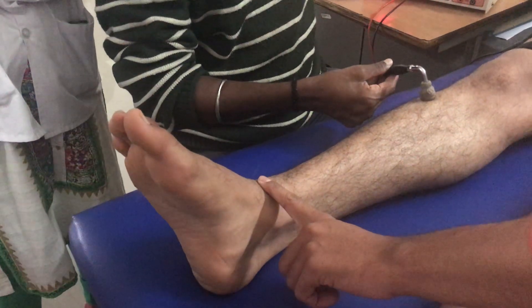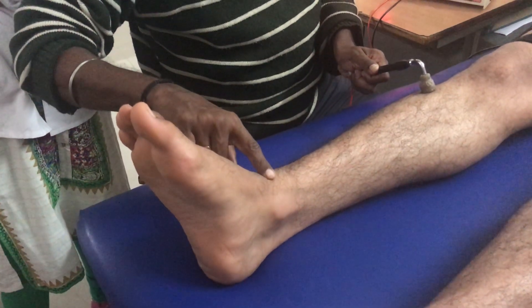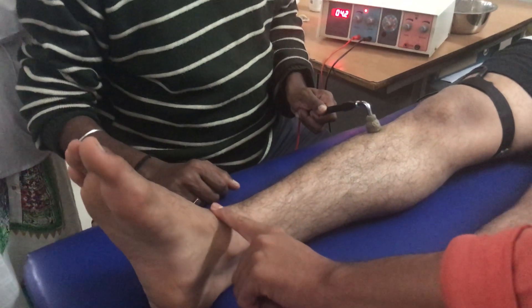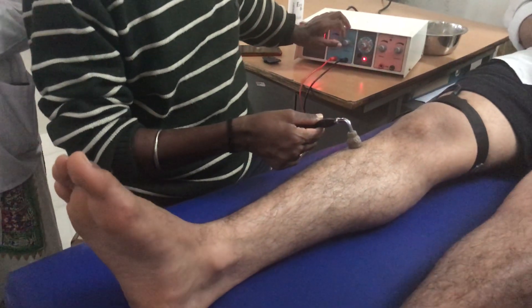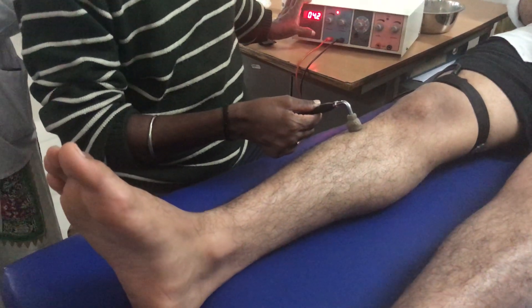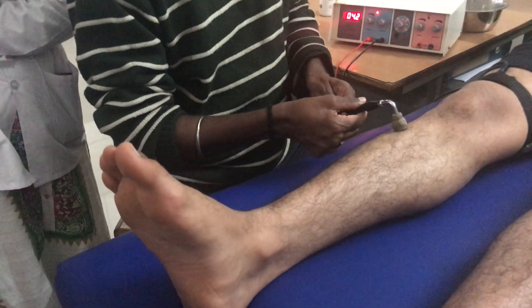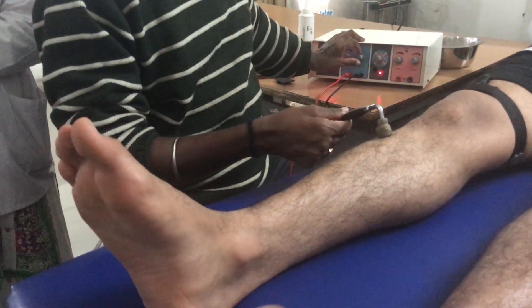At 10ms, the contraction seems to be lesser. Palpate — it is not that strong. So I am going to increase the intensity slightly. Now I have come back to the same strength again. Check — it is almost the same strength. I required 4.2 to 4.3mA; it was fluctuating, so I take the maximum value, which is 4.3. If the display fluctuates, take the highest value.